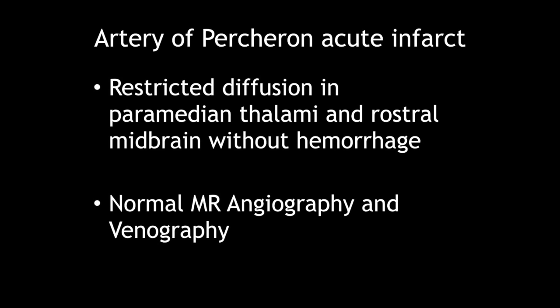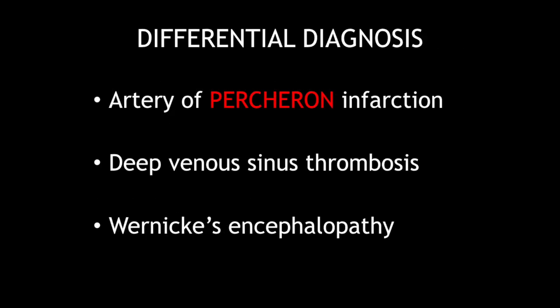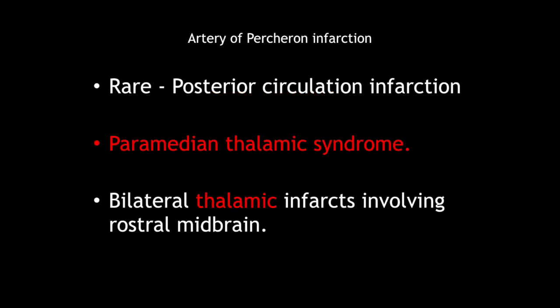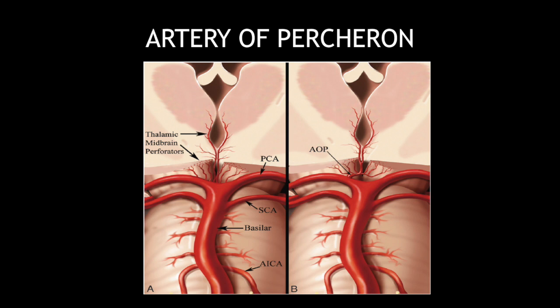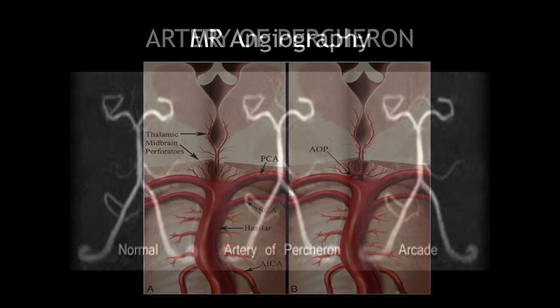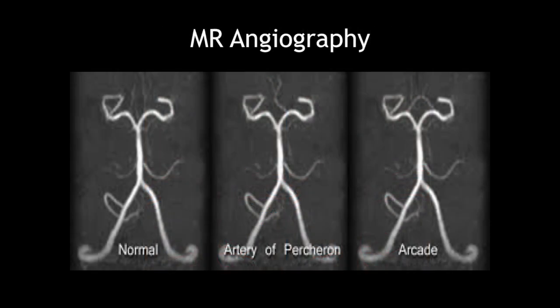The differential diagnosis for restricted diffusion in bilateral thalami includes artery of Percheron infarction, deep venous sinus thrombosis, or Wernicke's encephalopathy. This is also called paramedian thalamic syndrome and is a rare type of posterior circulation infarction. It occurs due to a solitary arterial trunk supplying bilaterally. This artery is very difficult to identify on MR angiography, but some images can demonstrate a single trunk supplying both sides.